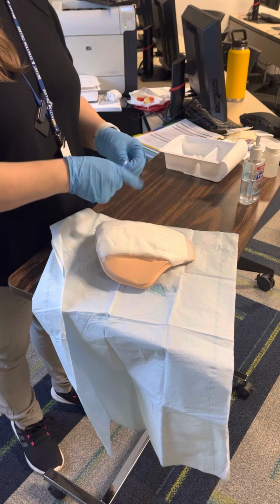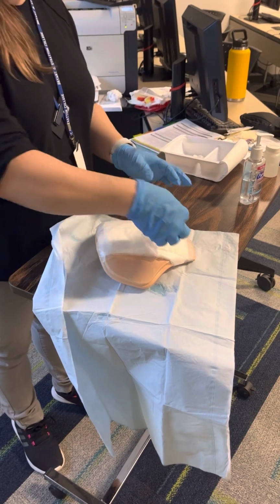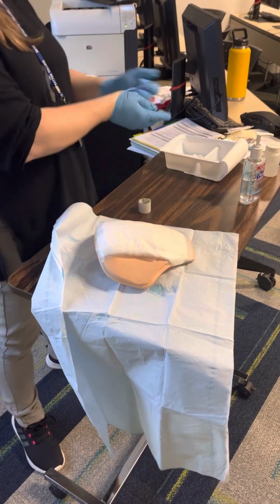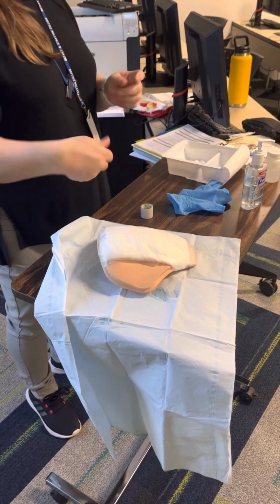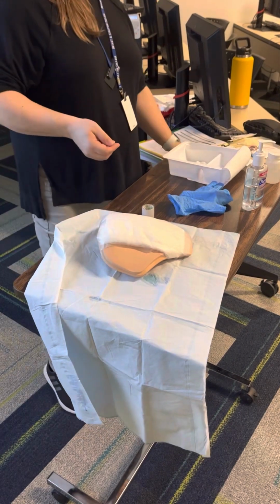I'm gonna take an additional piece of tape, date, time, and initial on the outside, and take off my gloves. Put new gloves on, get my patient into a comfortable position, hand the call bell.